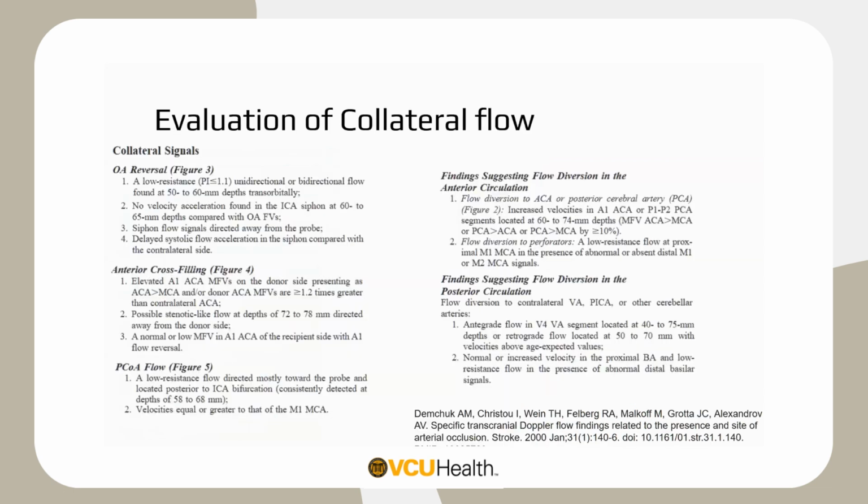Looking at collaterals, there's a few different things. It's similar to what we saw in the clinical case there. Really, what we're looking at with TCD is collateral status at the circle of Willis. So you can examine the reversal of the ophthalmic artery, cross-filling across the ACA, or try to characterize posterior to anterior flow across the PCOM. And our patient displayed all three of these.